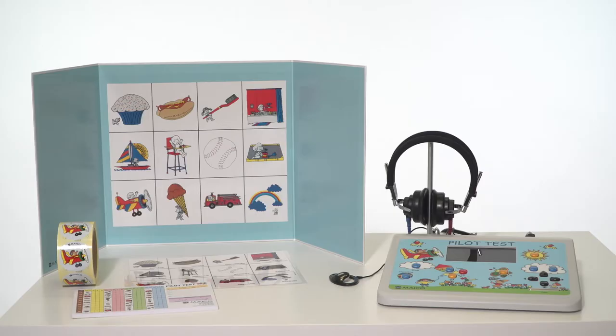Additional accessories include an English and Spanish select picture board for select picture audiometry, a laminated sheet for practice words for select picture audiometry, completion stickers, and a results pad.